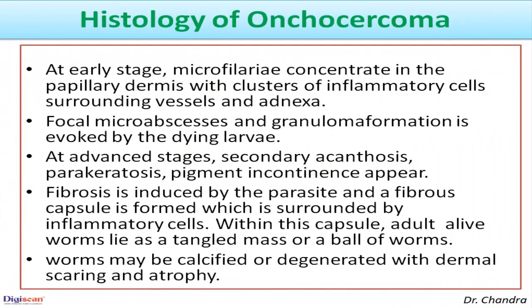Regarding the histology of onchocercoma: at the early stage, microfilariae concentrate in the papillary dermis with clusters of inflammatory cells surrounding vessels and adnexa. Focal micro-abscesses and granuloma formation are evoked by the dying larvae. At advanced stages, secondary acanthosis, parakeratosis, and pigment incontinence appear. Fibrosis is induced by the parasite and a fibrous capsule is formed, surrounded by inflammatory cells. Within this capsule, adult living worms lie as a tangled mass. Worms may be calcified or degenerated with dermal scarring and atrophy.